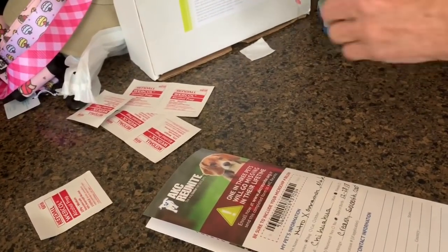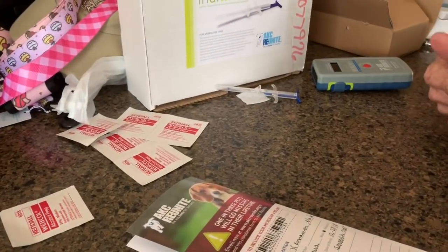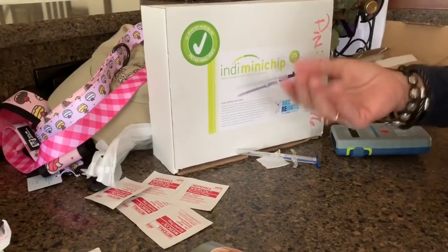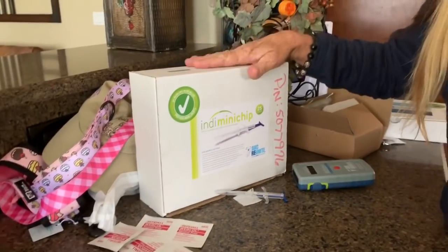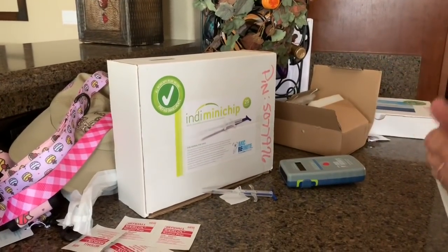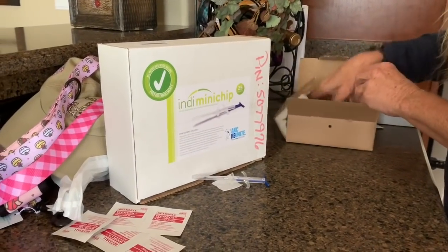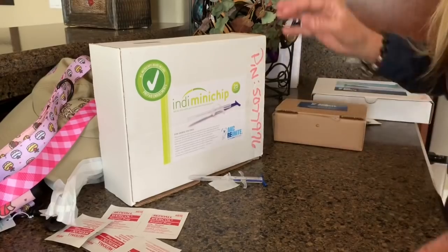That microchip will stay with him for his whole life, and if ever he's lost, he can be found. It's going to come back to me first as his breeder — I have these all registered to myself, but the new owner is also able to register in their name. So if they can't get ahold of the new owner, they will absolutely get ahold of me and I'll be able to pick up my babies from anywhere. For their whole life, I will always know where they're at. And that's it — that's a microchip.